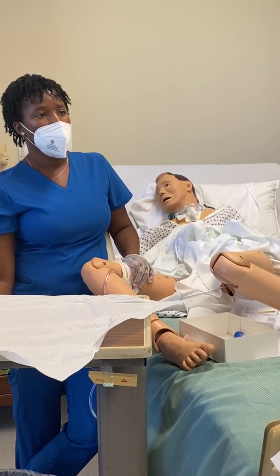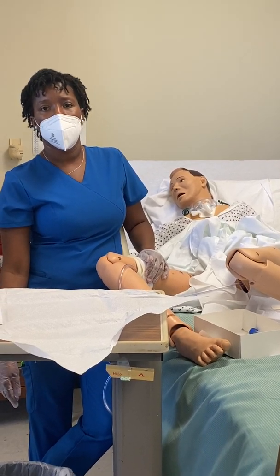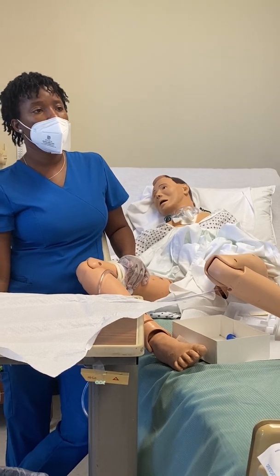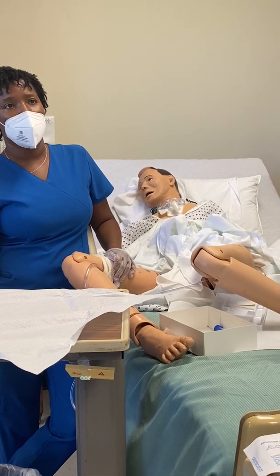So would you need to change your gloves though before touching their leg? No, you don't have to. Too deep, too deep, you guys. They should be sterile still, technically. Okay. Well, if you touch your vagina, you're too deep. So you can just continue with the same gloves and do everything once you get done? Yes, y'all thinking way too deep with that, okay?